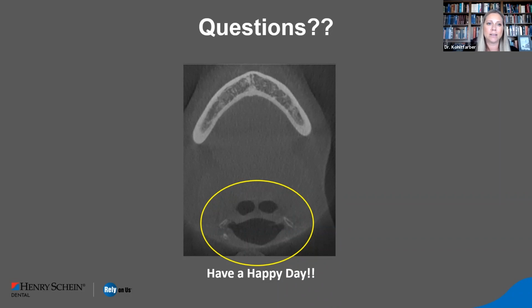We can say that a CBCT is actually less dose than some of those film-based full mouth series. In fact, you could have taken 3 CBCTs for what those original film-based full mouth series were. So certainly it's less dose than that. It's just a little bit more than a direct digital. A direct digital will be maybe about 4 pans, where a CBCT is 5 to 6 pans. It's a very negligible dose addition, and you're going to get a lot more information from that.